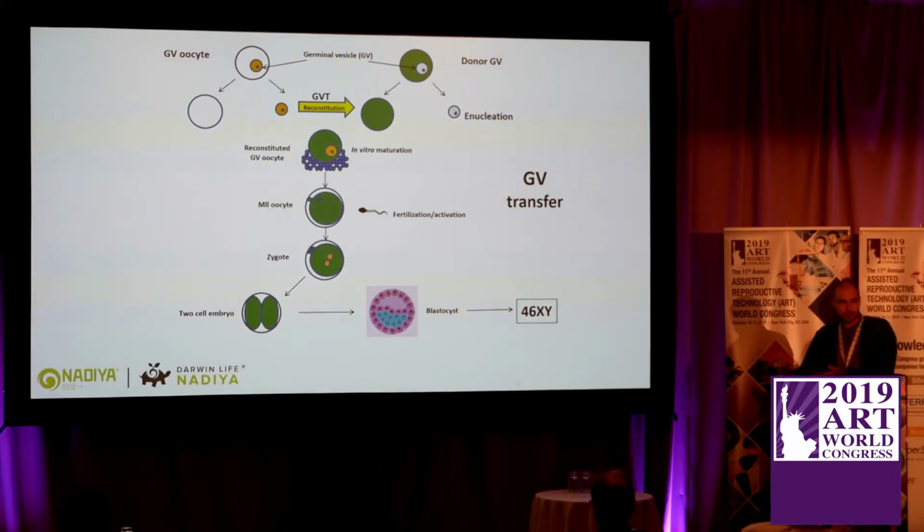But with the direct reconstitution, with the advanced maternal age nucleus and a young cytoplasm, we had some blastocysts, but all of them were aneuploid, and that's a very common thing for such patients.